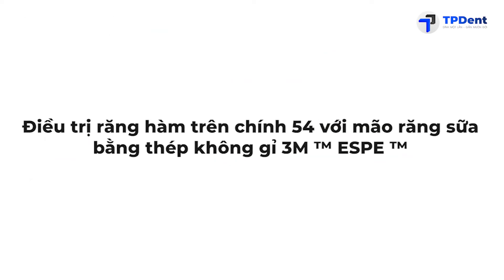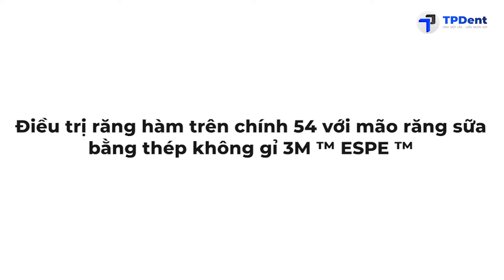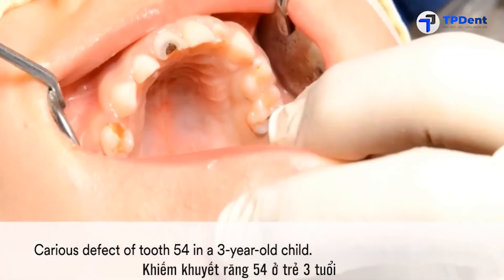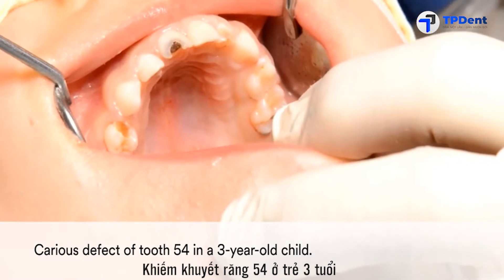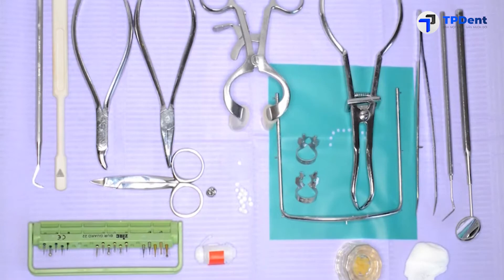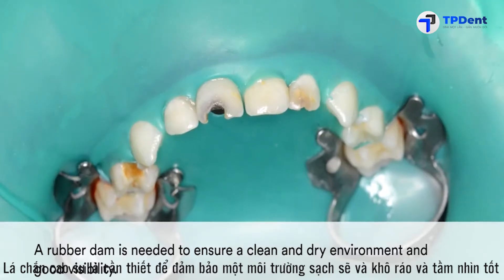This clinical case shows the treatment of Primary Upper Molar 54 with the 3M Stainless Steel Crown. In this case, a three-year-old child presented with a carious defect. Prior to starting the procedure, make sure to have all necessary materials and instruments handy on your tray.